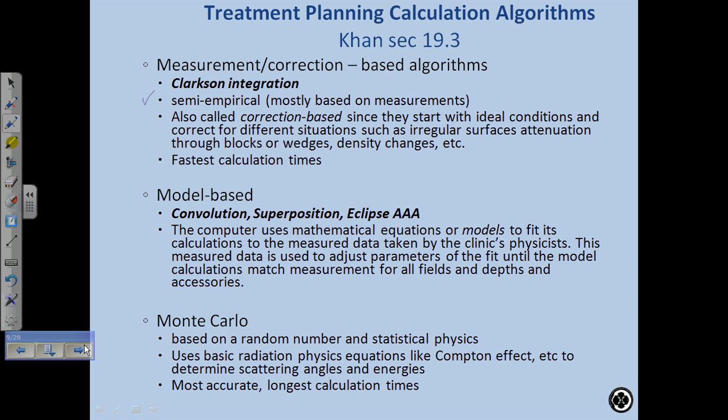Okay, so they take that data, and how do they do it? Well, how would you do it? If you've got some isodose curves, remember how we said we can plot isodose curves? If this is our tank, we can take our profiles and plot isodose curves like this. We could probably do this by hand if we had to.